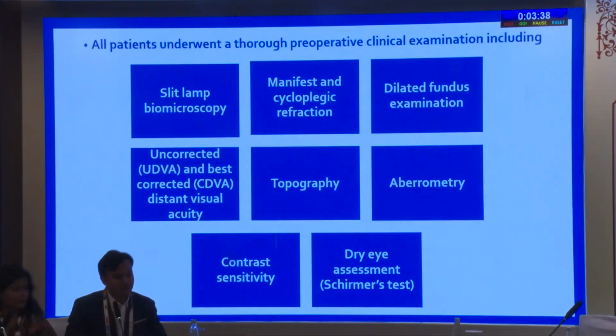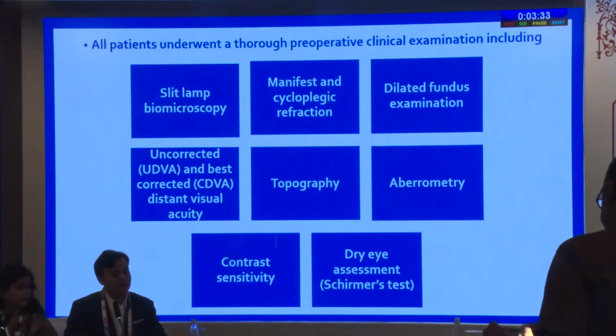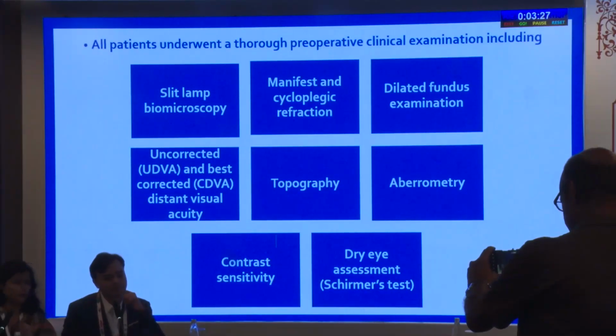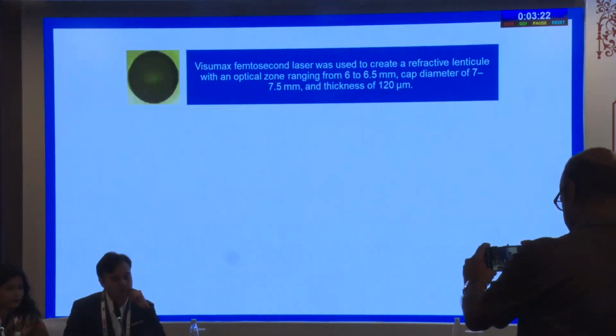All patients underwent a preoperative clinical examination, including slit lamp biomicroscopy, manifest and cycloplegic refraction, dilated fundus examination, uncorrected and best corrected distance visual acuity, topography, aberrometry, contrast sensitivity, and dry eye assessment.